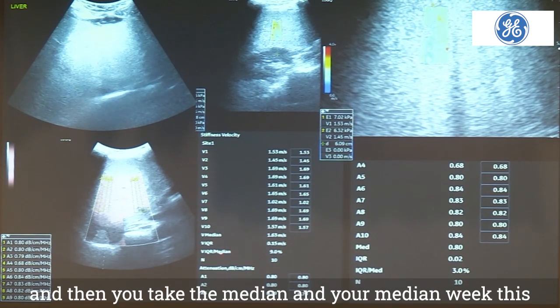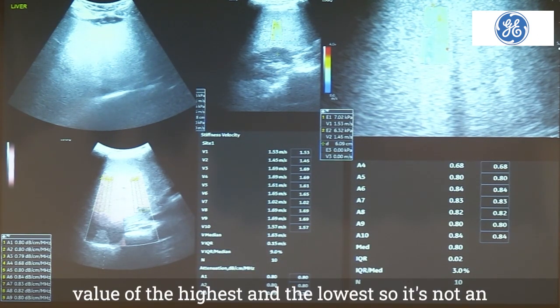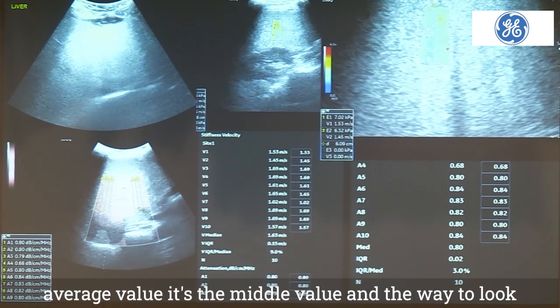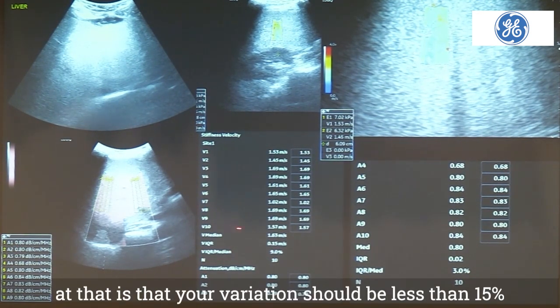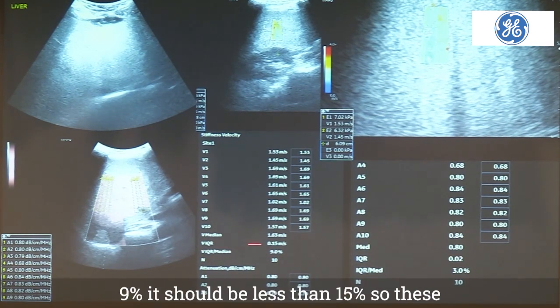This is the statistical range, where you should have a median value between the highest and the lowest. It's not an average value, it's the middle value. The way to look at that is that your variation should be less than 15%. What we call the IQR to median ratio, here it's 9%, and it should be less than 15%.